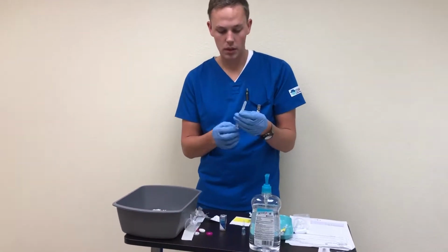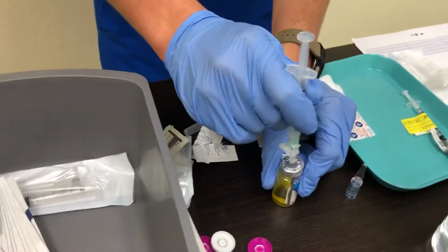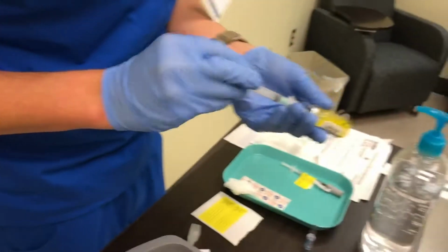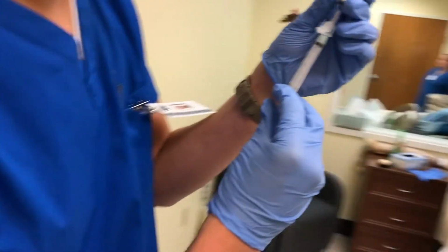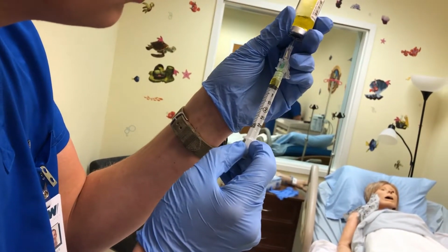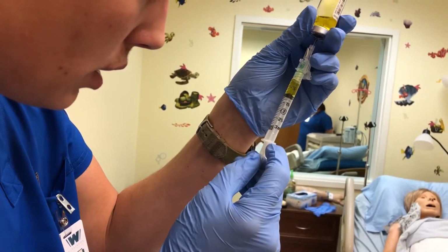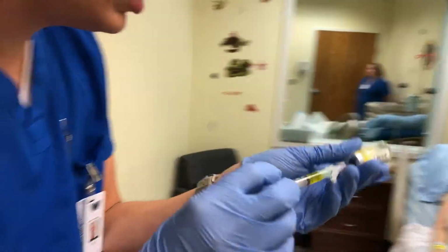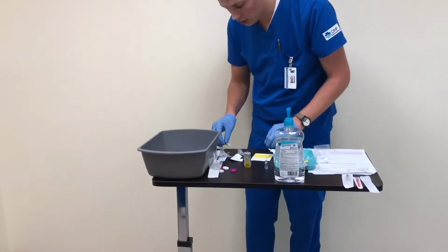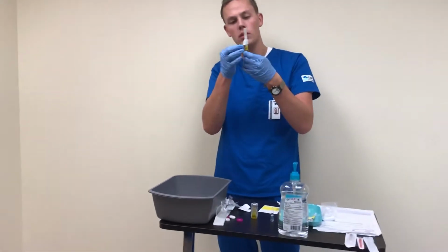So I still got that 1 mil of air in there. Okay, and I can uncap and push that in. Squeeze the air out. And then we're going to be pulling out that 1 mil, making sure the needle's fully submerged. And we can just start pulling out that medication. And reading it at eye level. There is my 1 mil of medication. I'm using a safety sweep. I'll put the needle back on, making sure to get any air bubbles out.